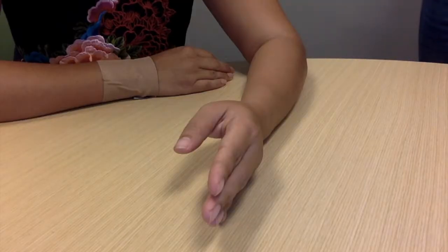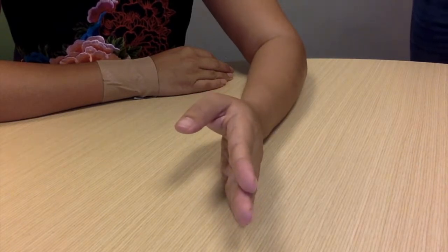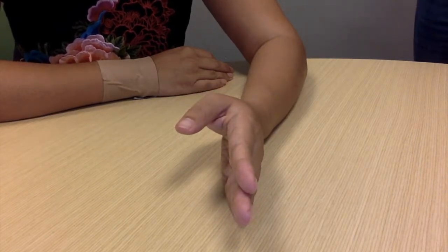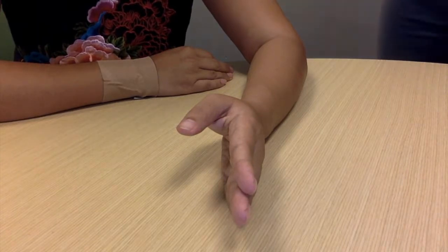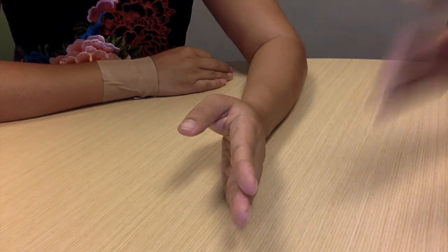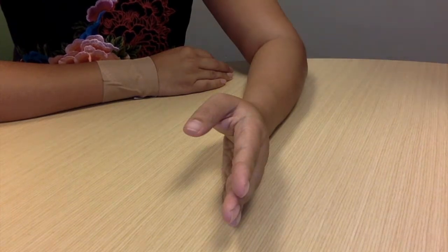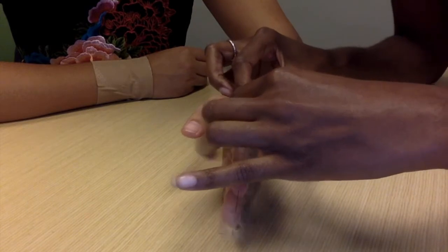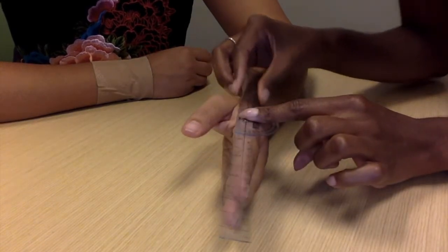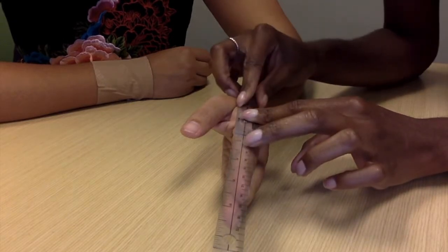For MP hyperextension, the normal range is 0 to 45 degrees. The patient is seated with the forearm in mid position, the wrist at 0 degrees neutral position, and the IP joints relaxed or in flexion. The forearm and hand are supported on a firm surface on the ulnar border. The axis is placed on the lateral aspect of the MP joint of the index finger. The stationary arm is parallel to the metacarpal. The movable arm is parallel to the proximal phalanx.